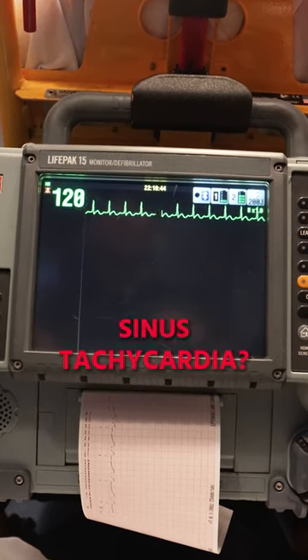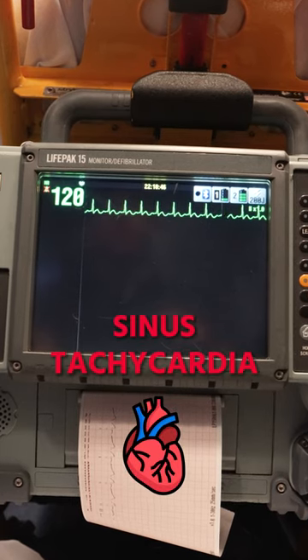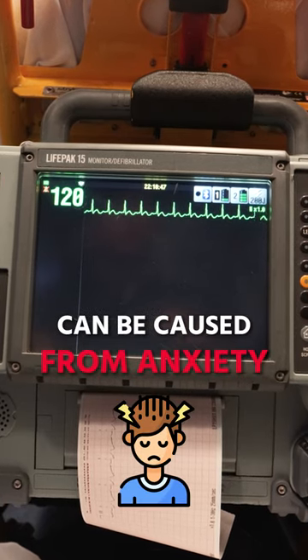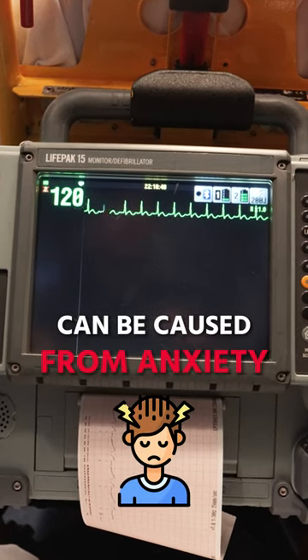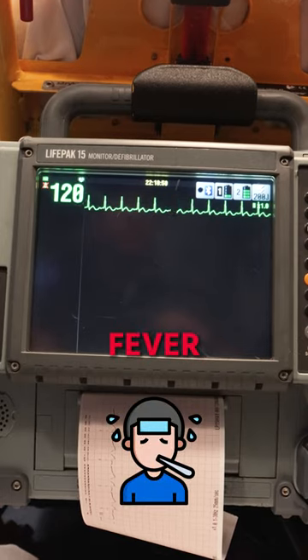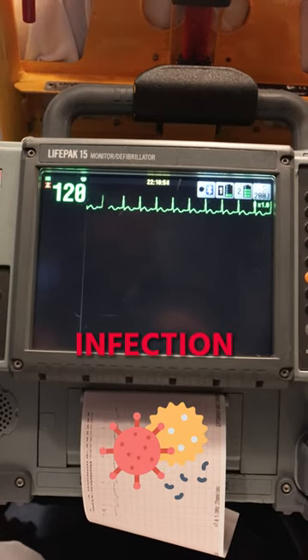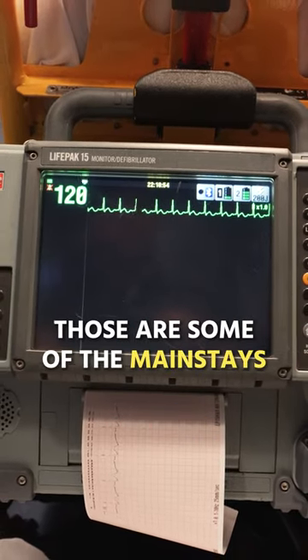Why do we have sinus tachycardia? Sinus tachycardia can be caused from anxiety, pain, fever, or infection. Those are some of the mainstays.